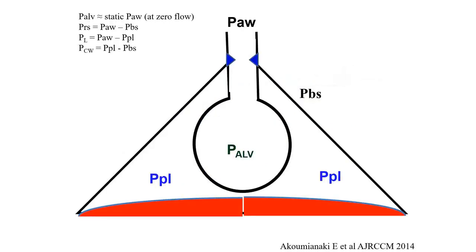So why do we measure esophageal pressure? Because we want a surrogate of pleural pressure. And the pleural pressure is the pressure surrounding the lungs. And in this era of protective lung ventilation, this is the only way to precisely know what is the real distending pressure of the lung. Okay, if you measure the pressure at the airway opening, you just have the total pressure, which is moving the lung plus the chest wall. If you just want to know the pressure which is simply distending the lung, and subtracting the pressure moving out the chest wall, you need to measure this pleural pressure.